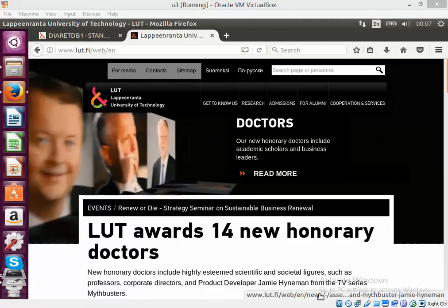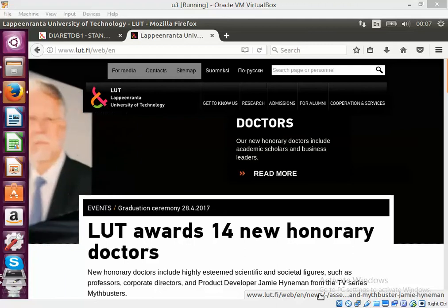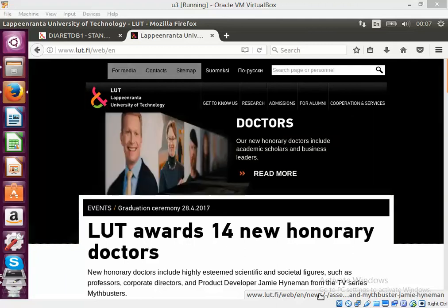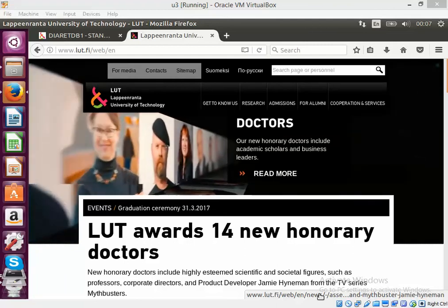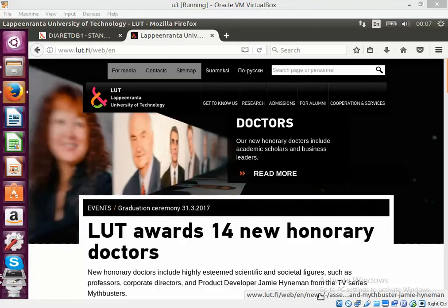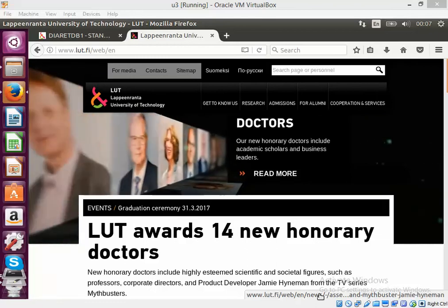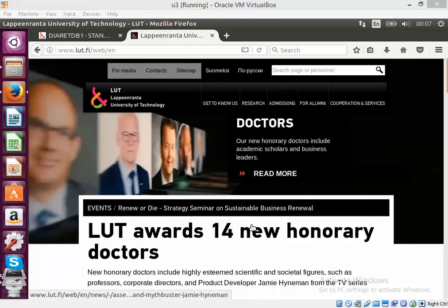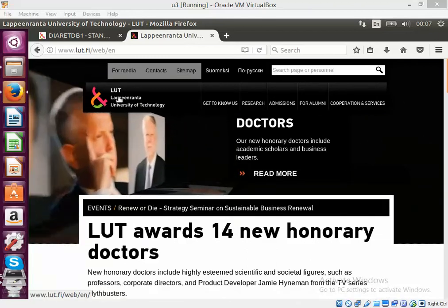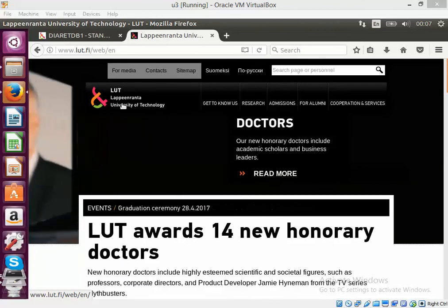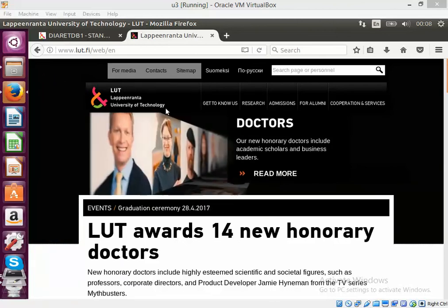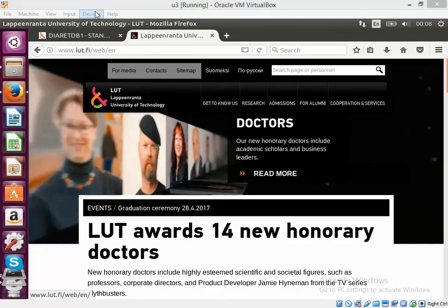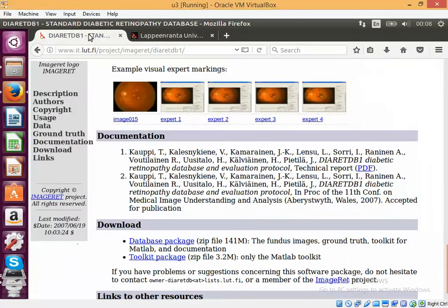Today I would like to show you image classification of medical image processing use case where I will use the data provided by Lappeenranta University of Technology or LUT. They have a very interesting project.